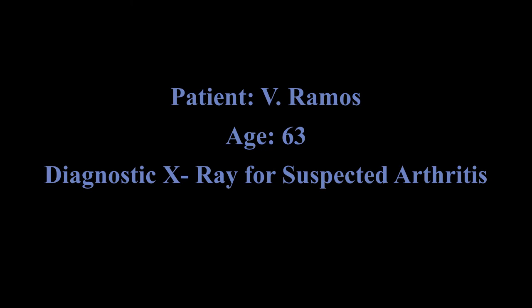Our topic for today is about knee x-ray, and with my patient, my mother, a 63 years old female, experiencing stiffness and lacking of joint, weakness or instability, difficulty on moving or straightening of the knee.